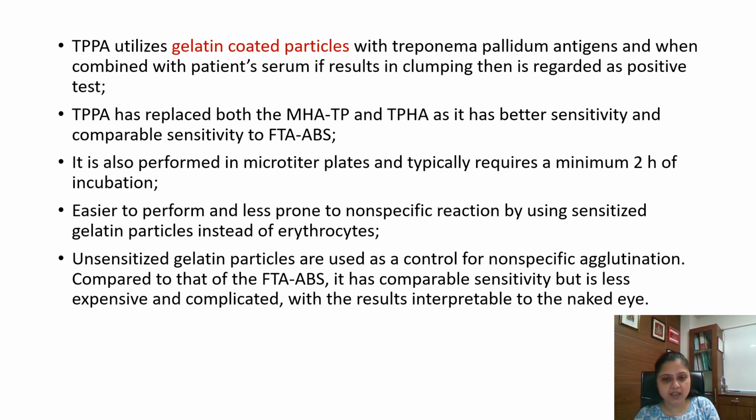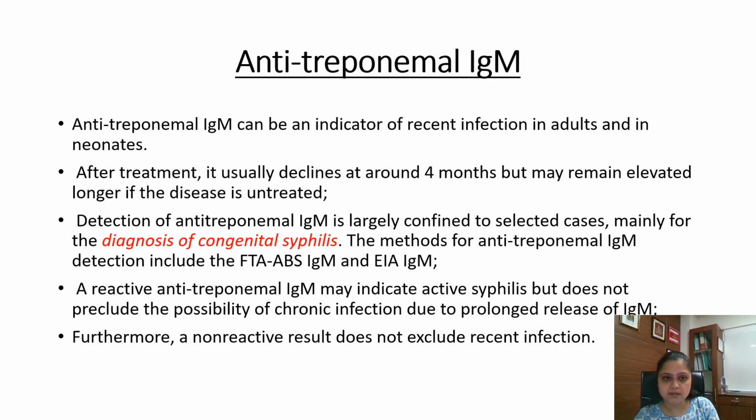Compared to the FTA-ABS, this has a comparable sensitivity. However, it is less expensive and complicated. So the results are, most importantly, something we can appreciate with the naked eye.